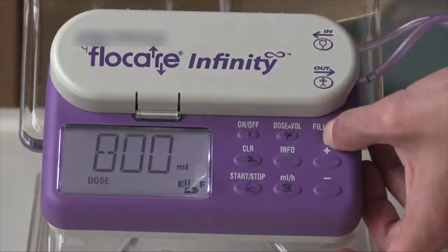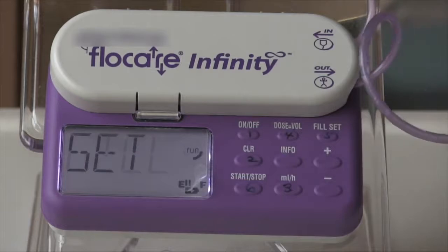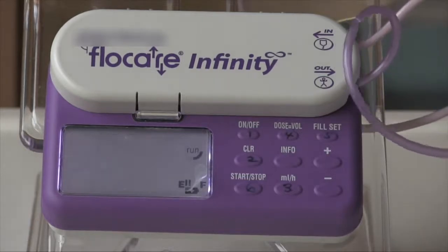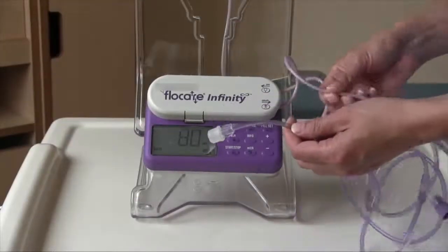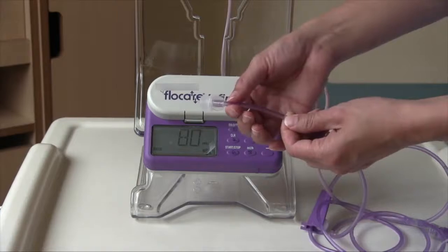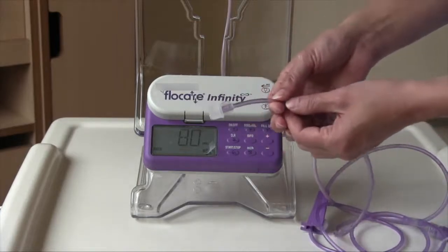So you'll push and hold for 2 seconds. You'll hear a beep and it will say fill set. So you'll notice now that the feed is being pushed through the tubing, and there will be air that will be pushed out. During the fill set function, as your feed is filling the line, it will automatically come to about 1 to 2 centimeters before the end of the tube, which is okay.